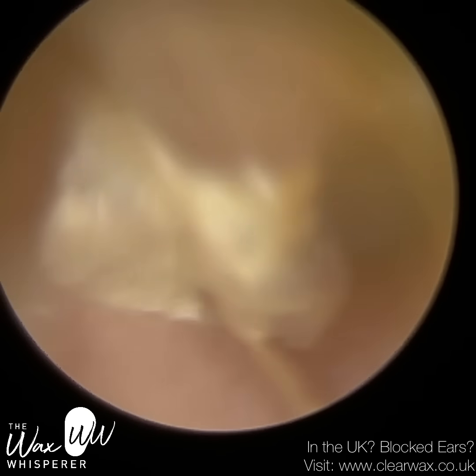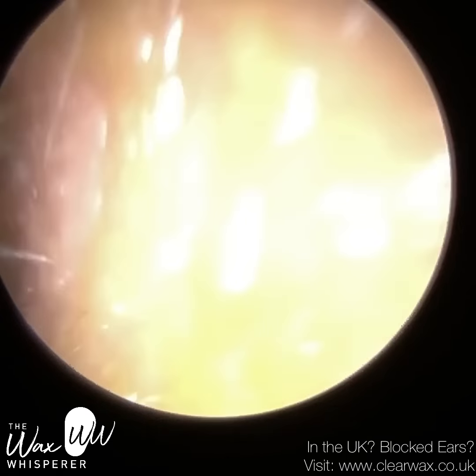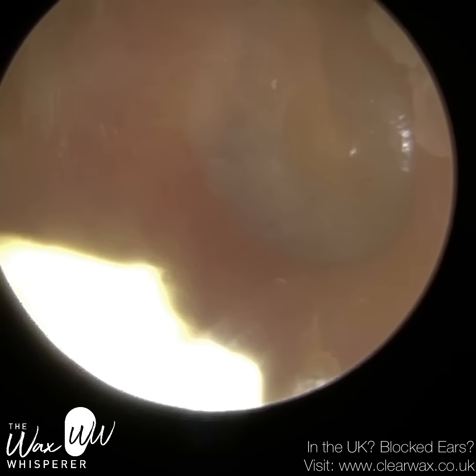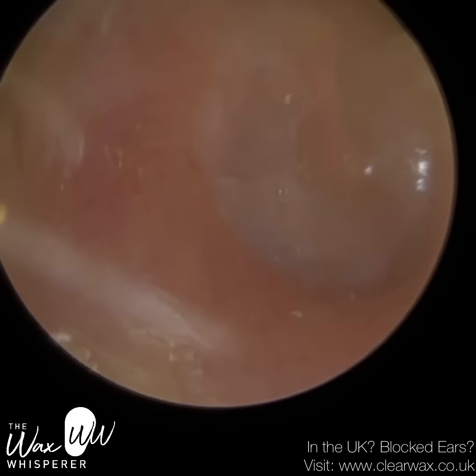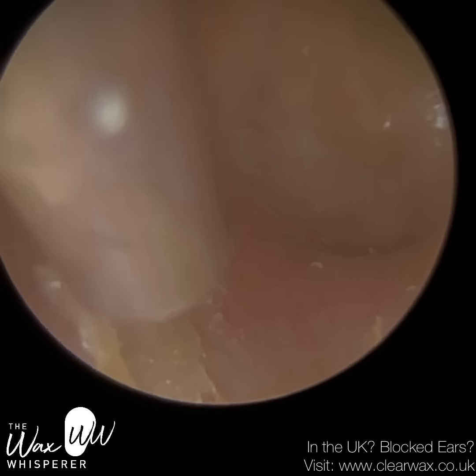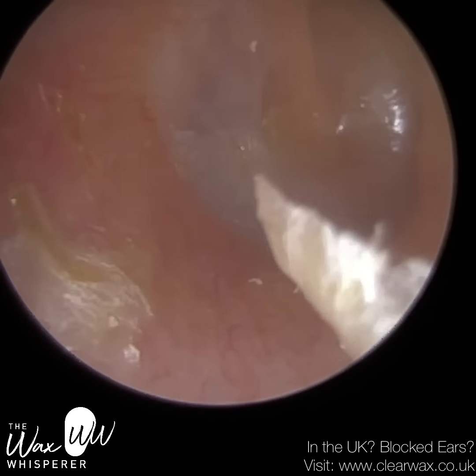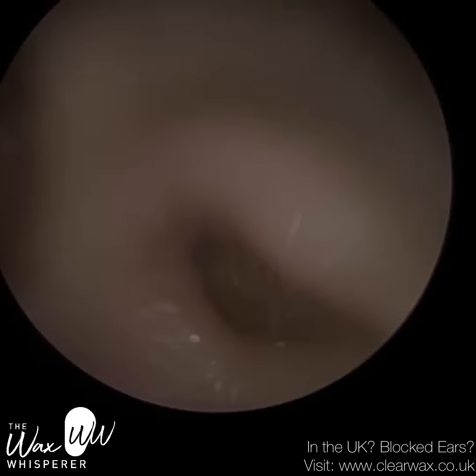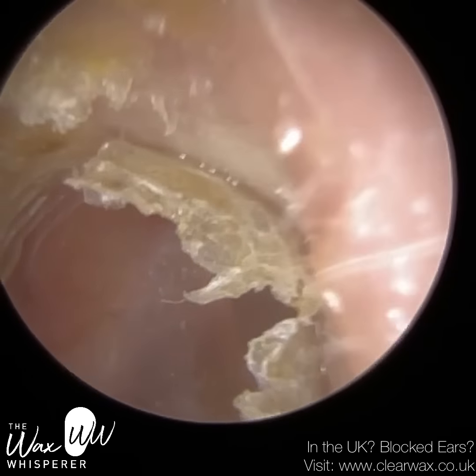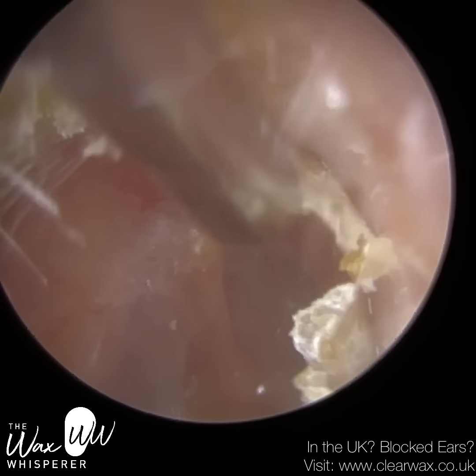And the patient was brilliant. We're always checking on the patient to make sure they're okay, and they're actually quite enjoying the procedure because, as I said, the patient's got this itchy ear because of this skin layer. So me just trying to remove the skin for them gives them great relief. A lot of patients with itchy ears naturally tend to poke and prod inside to relieve the itch. This patient's no different.